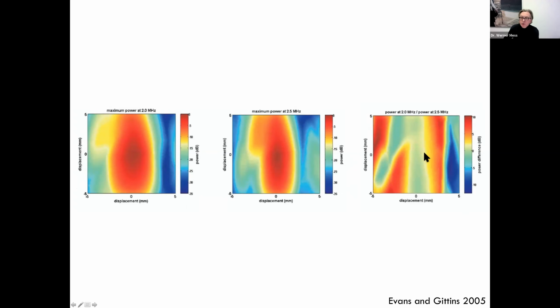The differences are considerable. This goes up to 3, 4, or 5 dB. So the probability that you make an error concerning the correct classification between gaseous and particulate emboli is pretty high. That is a pity, because it would be very important to be able to discriminate gaseous and particulate emboli consistently, not only under these circumstances, but I think there is still a lot of work to do before we are really able to do it.